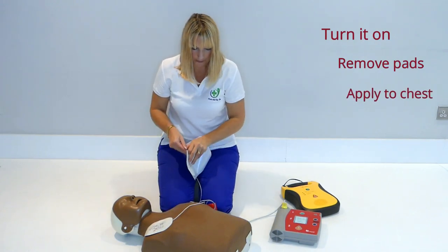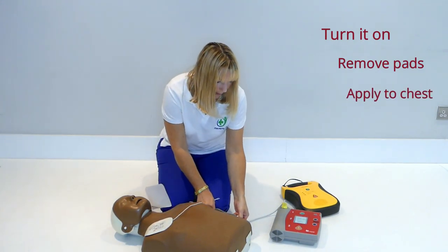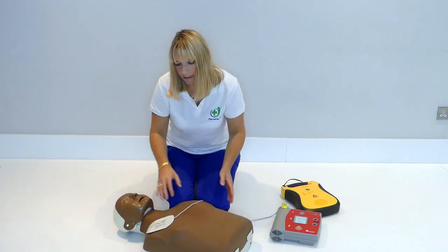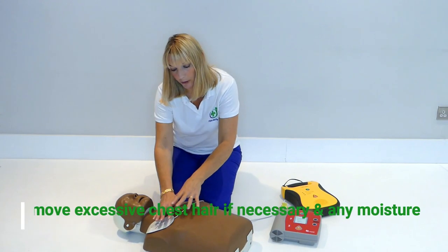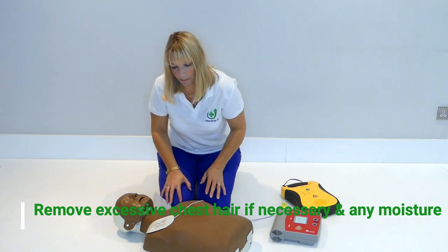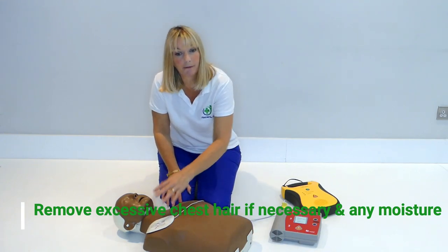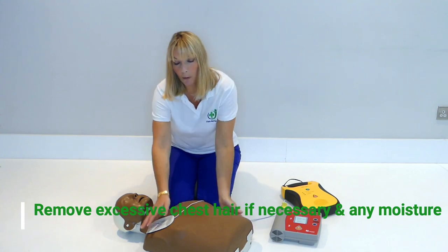Put one pad on this side of the chest, one on this side of the person. If they are very hairy or their chest is wet, you would dry the chest and maybe take a little bit of the hair off with a razor. You want maximum adhesion of the pads.